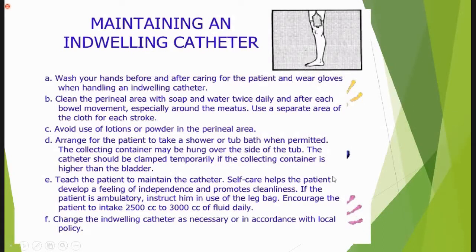If the patient is ambulatory, instruct him in use of a leg bag. Encourage the patient to intake 2500 cc to 3000 cc of fluid daily. Change the indwelling catheter as necessary or in accordance with local policy.